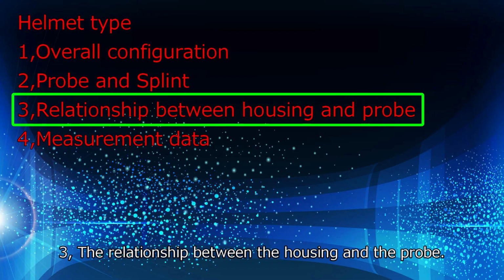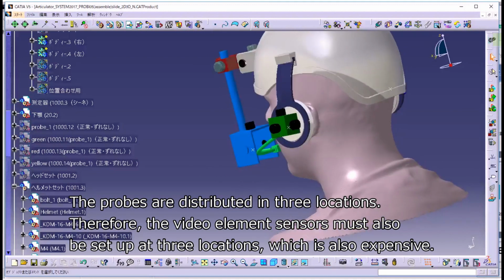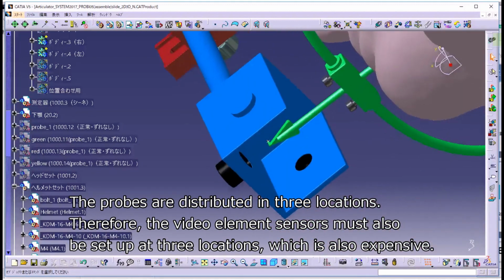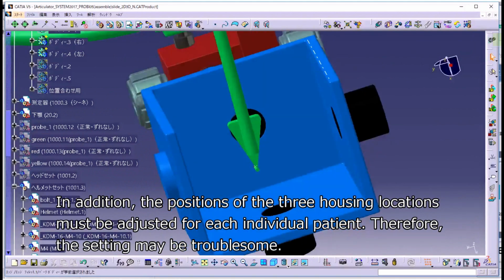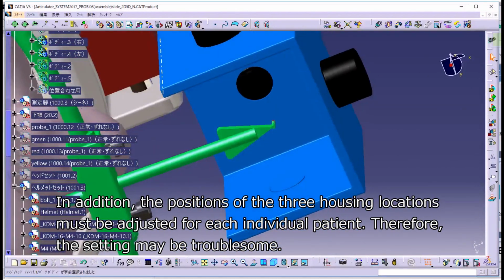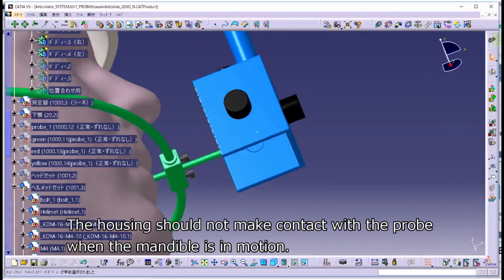3. The relationship between the housing and the probe. The probes are distributed in 3 locations. Therefore, the video element sensors must also be set up at 3 locations, which is also expensive. In addition, the positions of the 3 housing locations must be adjusted for each individual patient. Therefore, the setting may be troublesome. The housing should not make contact with the probe when the mandible is in motion.